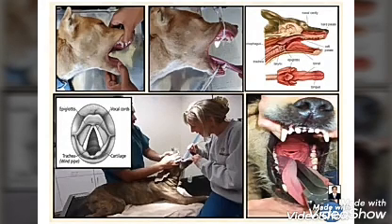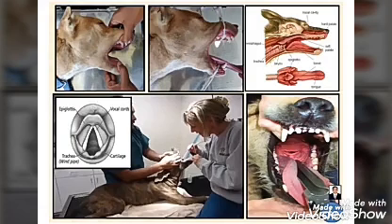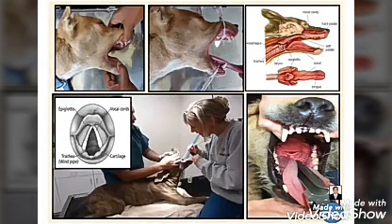So now endotracheal intubation is carried out with a suitable size of endotracheal tube under the guidance of the laryngoscope or by the blind technique. Some persons perform the blind technique. This skill is developed by such persons, so they blindly perform the endotracheal intubation without using the laryngoscope.